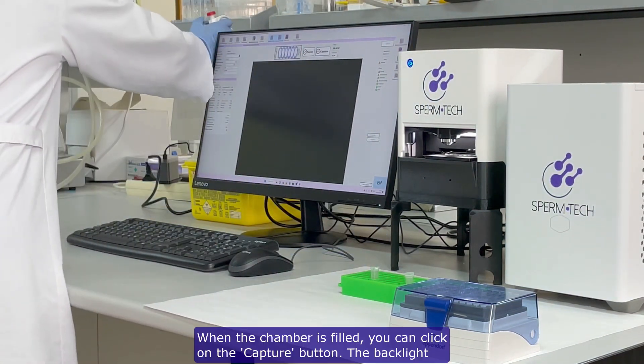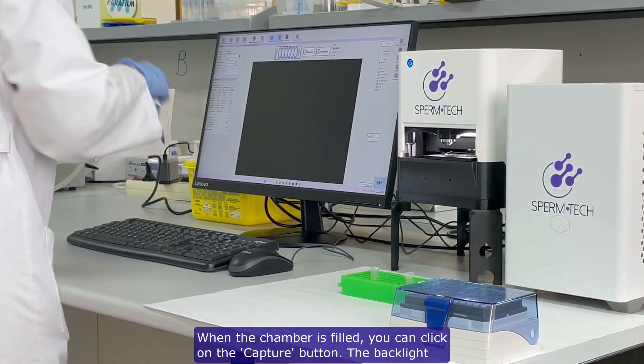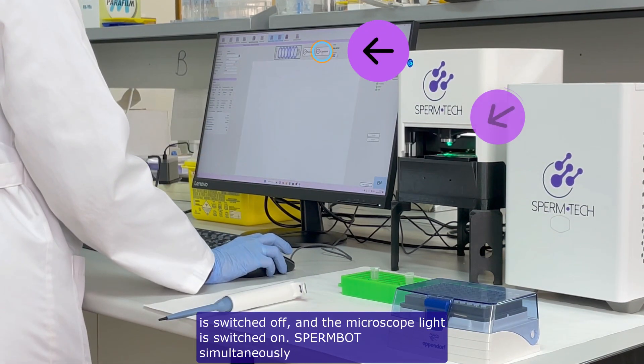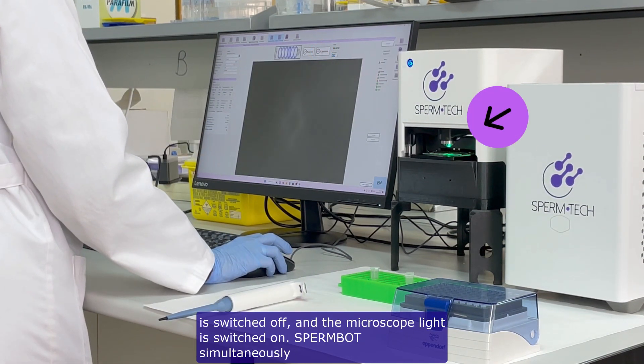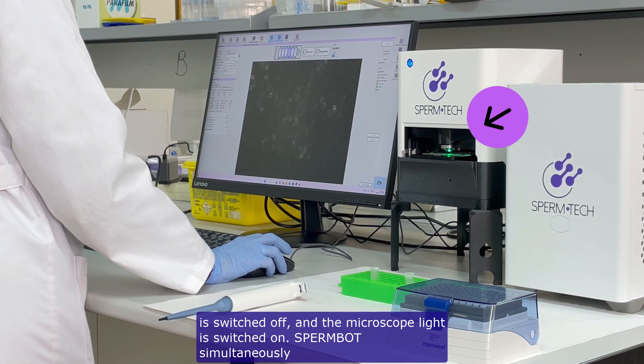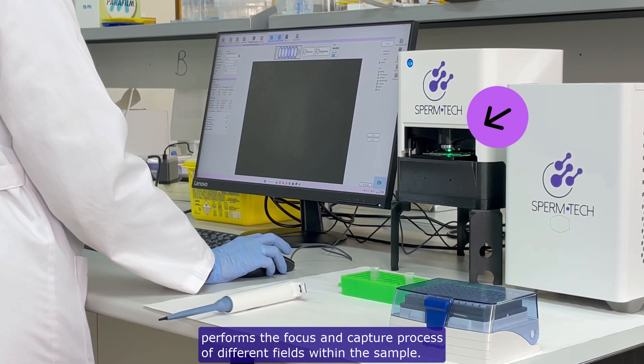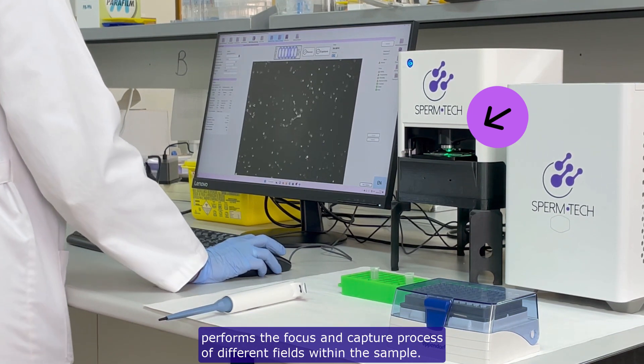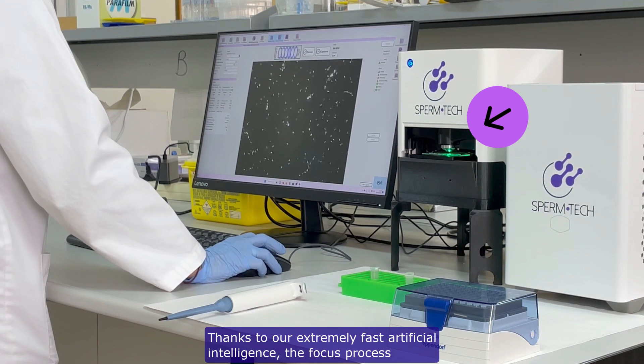When the chamber is filled, you can click on the capture button. The backlight is switched off, and the microscope light is switched on. Spermbot simultaneously performs the focus and capture process of different fields within the sample.